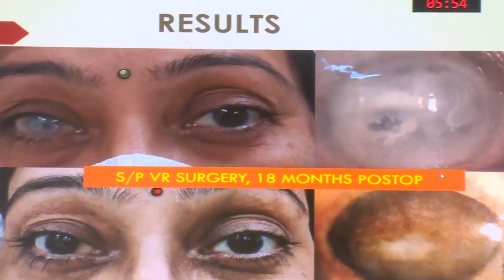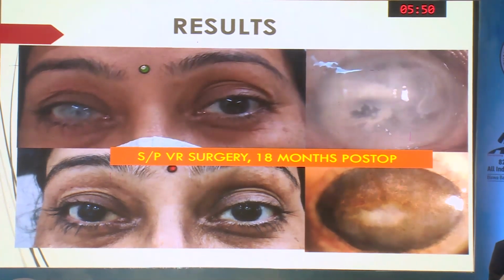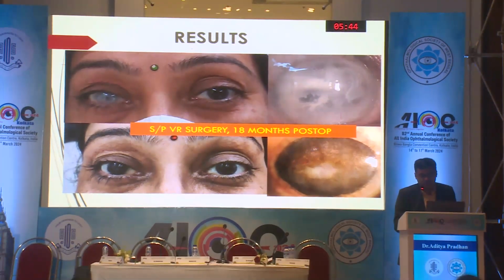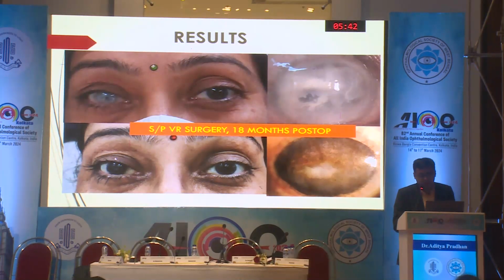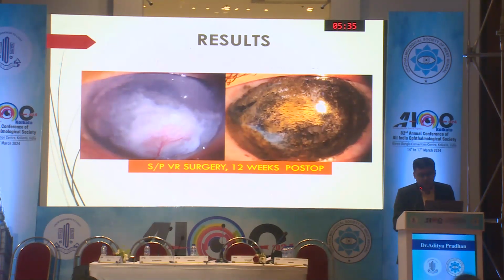So this is again a lady who was blinded post VR surgery. So this is after 18 months. Upon close examination on the slit lamp, you can see the mix of the gold and the black color, but from a distance it all appears cosmetically acceptable. This was the pre-op photo. This is again status post VR surgery. This is 12 weeks, that is 3 months post-op.